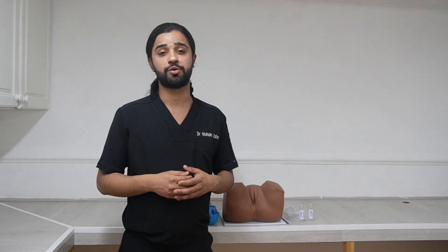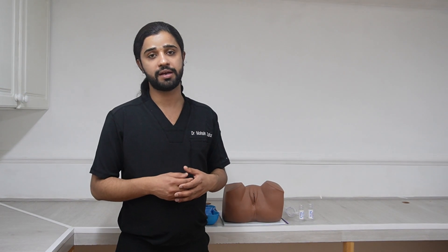Hello everyone, this is Dr. Mohsin and today I am going to teach you how to do the per-speculum exam and how to take a pap smear.